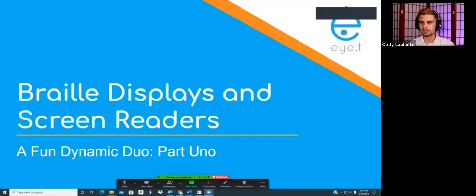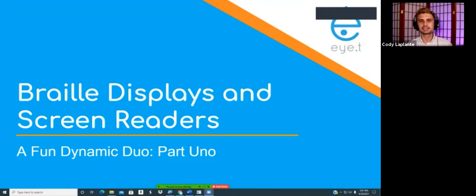And as I do, I'm going to start talking about Braille displays. Today, we're going to be talking all about Braille displays and how they work with screen readers. Today's session is called A Fun Dynamic Duo, Part Uno. Why? Because this is part one of two parts. Today, we're going to be focusing on just the fundamentals, the basics of using a Braille display with a screen reader. And in the next section, coming up in a couple of weeks, we'll continue that conversation. So today is just part one of two.